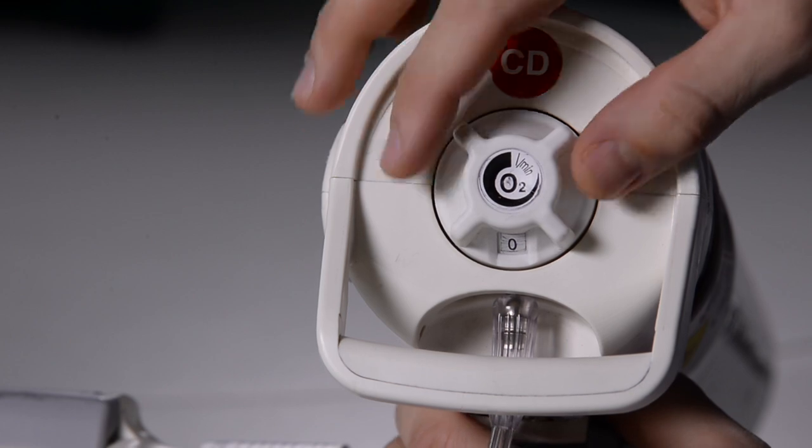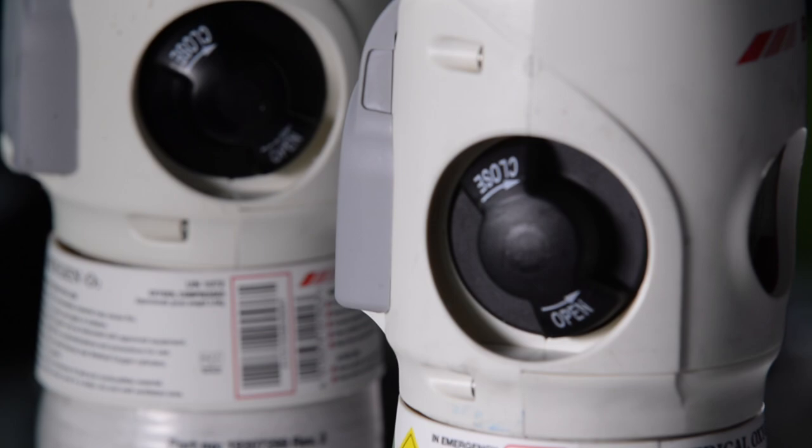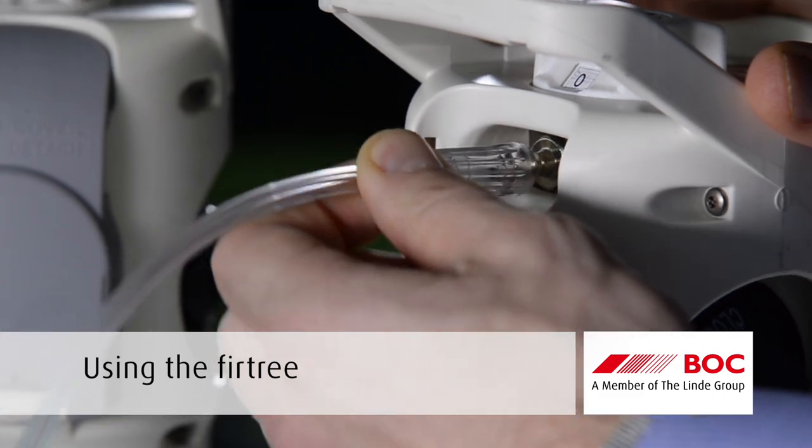Ensure the flow selector on top of the cylinder is set to zero and the hand wheel is turned off before connecting the equipment. Attach tubing from mask or nasal cannula to the fir tree outlet securely.